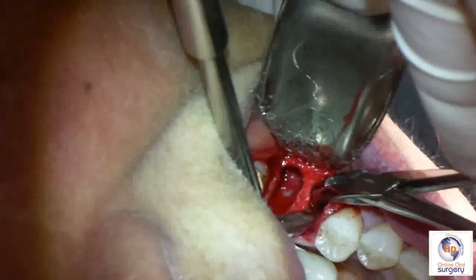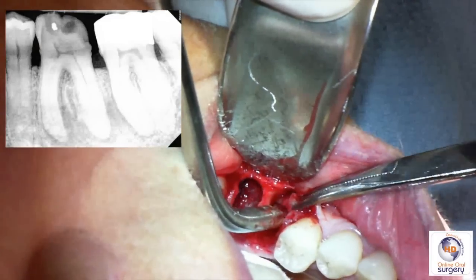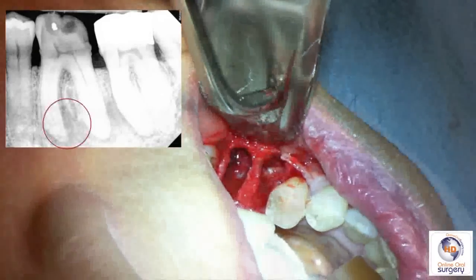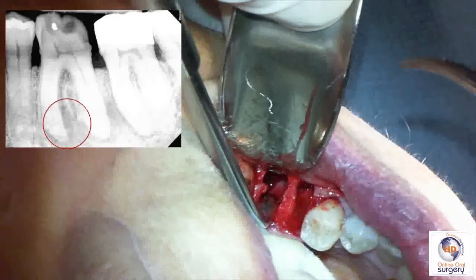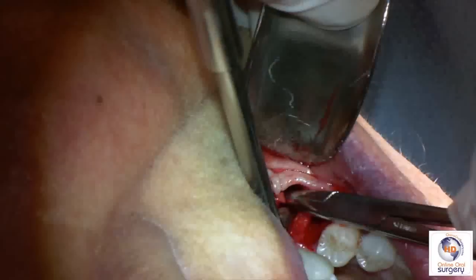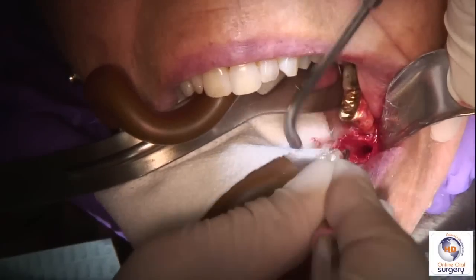You'll notice there's a fair amount of granulation tissue in this extraction socket, and if we look at the radiograph again, you can see the radiolucency within the bone. We've got a lot of infected material in here that we need to curette out extremely thoroughly. We don't want to leave any debris in there because that will interfere with healing of our graft and potentially perpetuate chronic infection within the socket — which is the last thing we want if we're doing a bone graft.